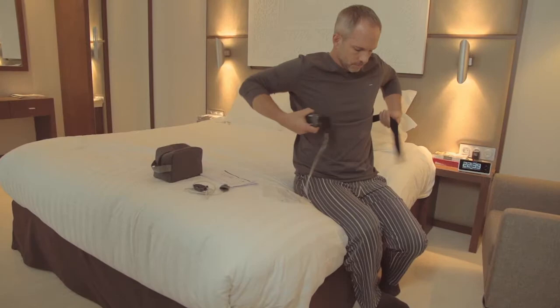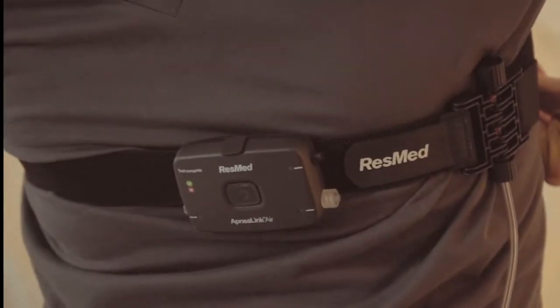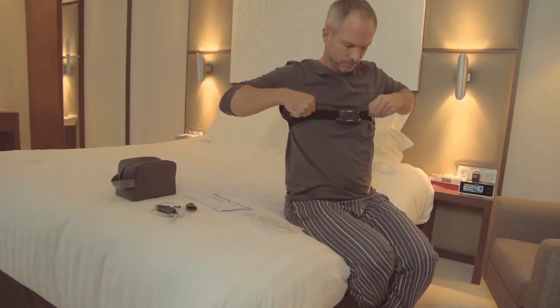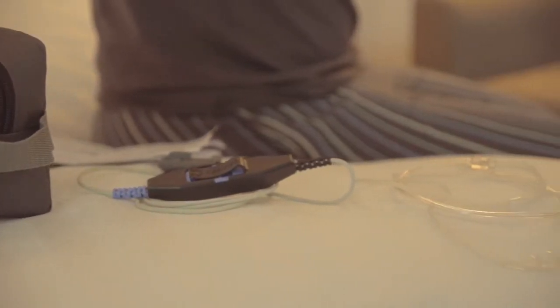The ApneaLink Air recorder and effort sensor will most likely already be attached to the velcro belt supplied. Before you go to bed for a normal night's sleep you need to assemble and attach the components.